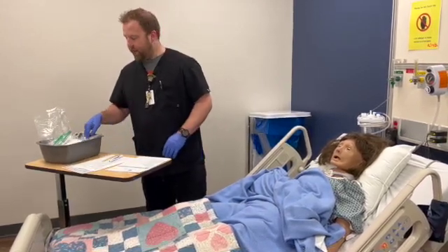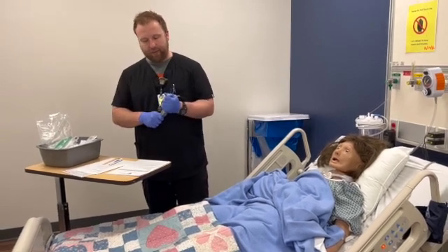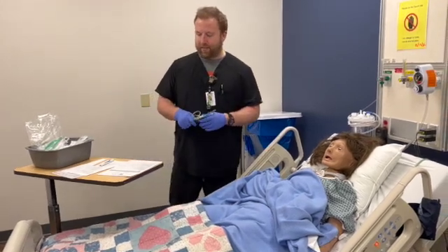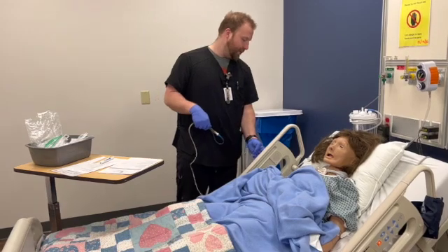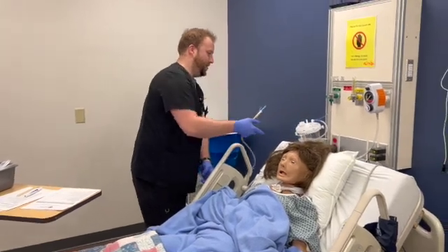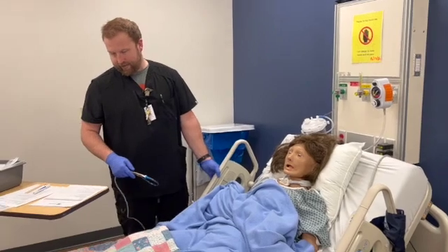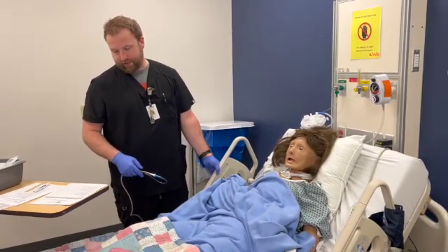I would take the tubing out of the package. It wants you to warm it up with your hands. After we do this, I want to put on clean gloves, and I want to start measuring for the NG tube placement. Make sure your patient is in a high Fowler's position.